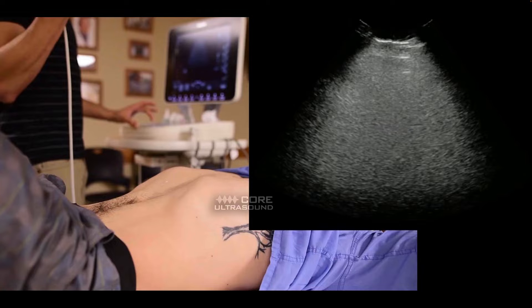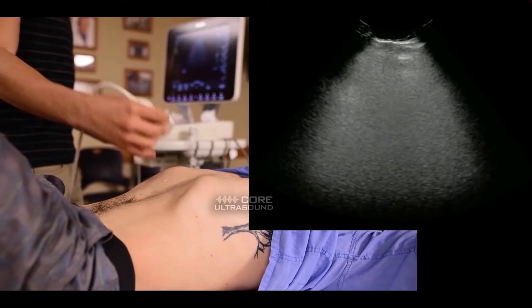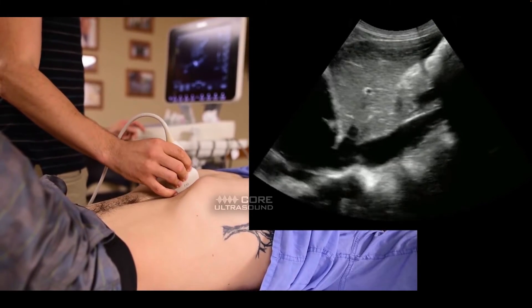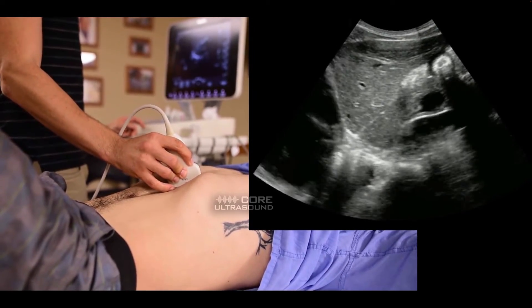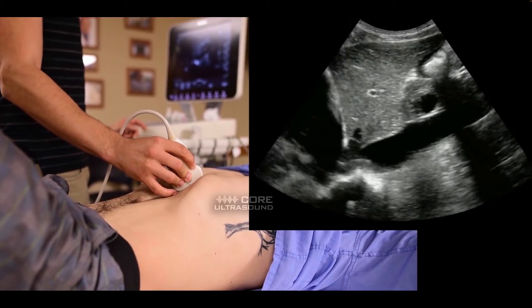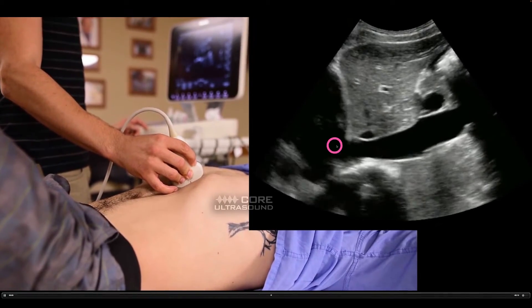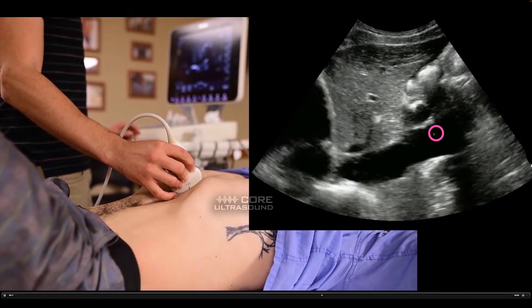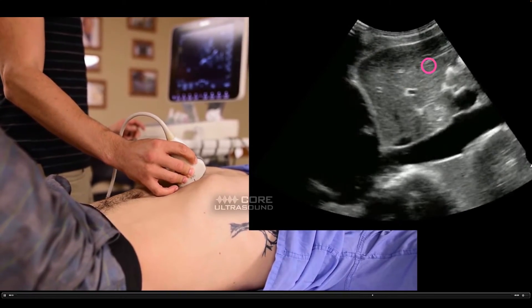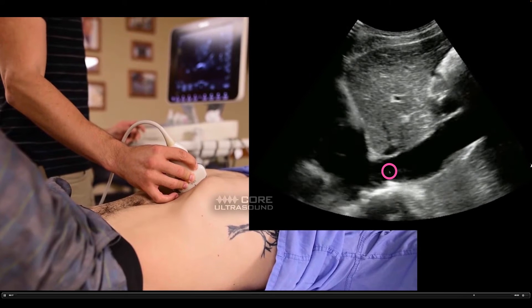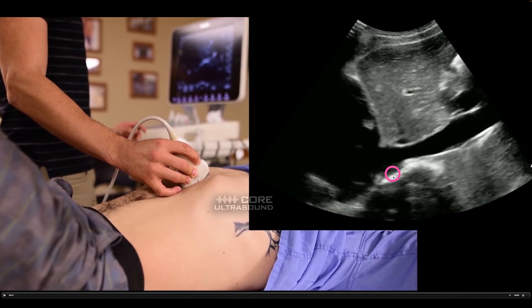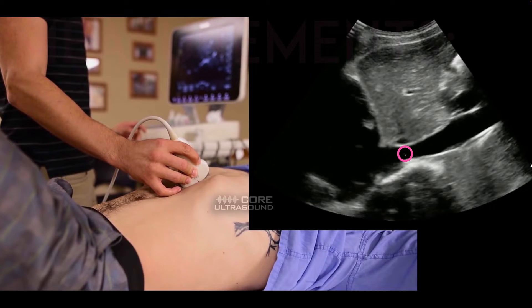With regards to placement, the most common place is in the sub-xiphoid or subcostal window with the probe marker facing up. You want to see the IVC right as it enters into the right atrium — right here. This is the IVC, here is the liver, here's a bit of bowel, and what we want to do is get a few cycles of respiration and see what the change of that diameter is.